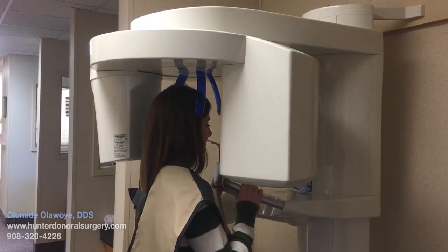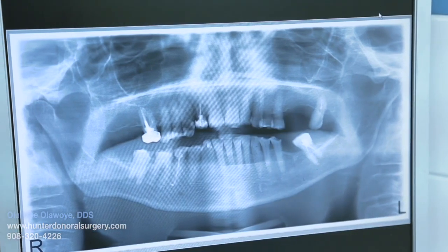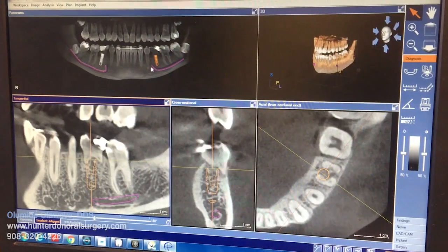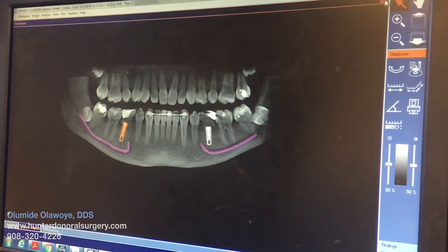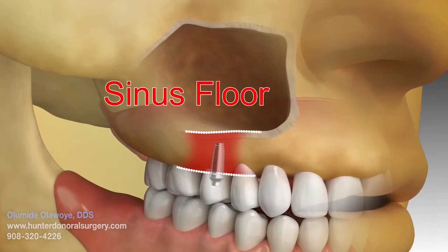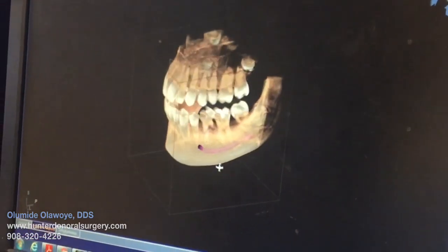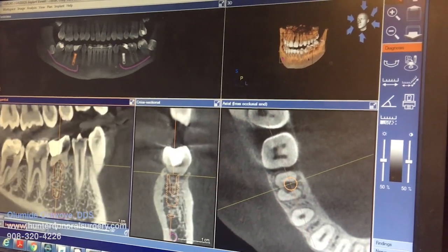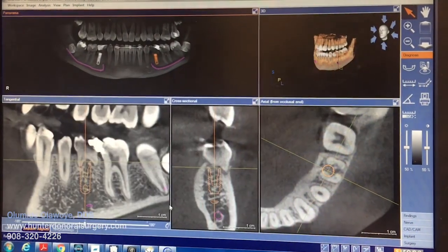During the consultation, a comprehensive oral exam is done together with a panoramic and dental CAT scan exam. This is to verify there's adequate bone for dental implant placement. It also allows us to see pertinent anatomical structures such as the sinus in the upper jaw and nerve in the lower jaw. The dental CAT scan also allows virtual placement using implant planning software in order to make actual implant surgery more predictable.